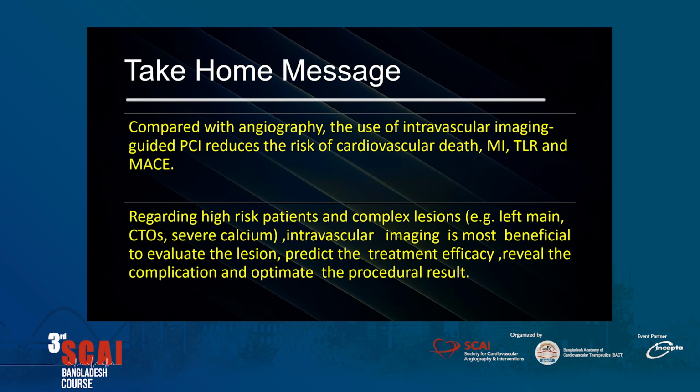Take home message: compared with angiography, the use of IVUS-guided PCI reduces the risk of cardiovascular death, MI, TLR, and MACE. Regarding high-risk patients and complex lesions, for example left main, CTO, severe calcium, IVUS imaging is most beneficial to evaluate the lesion, predict the treatment efficacy, reveal complications, and optimize the procedure result. So I gave 3 cases as 3 examples of when we benefit from using IVUS. Case number 1 with pre-intervention, case number 2 post-intervention, and case number 3 is in a special case.